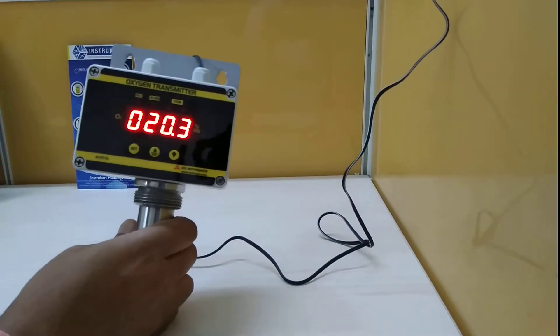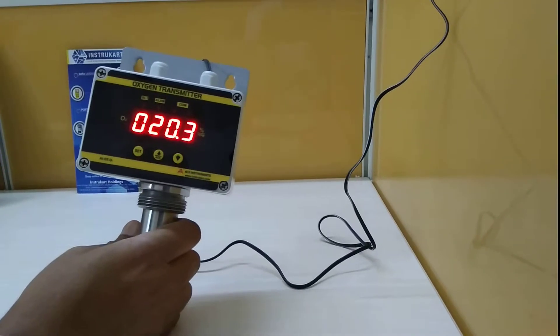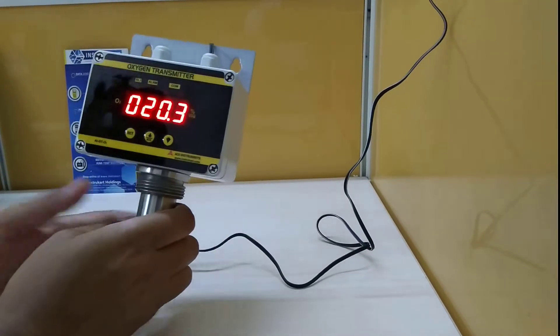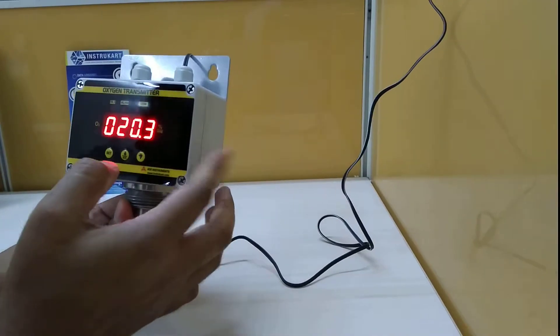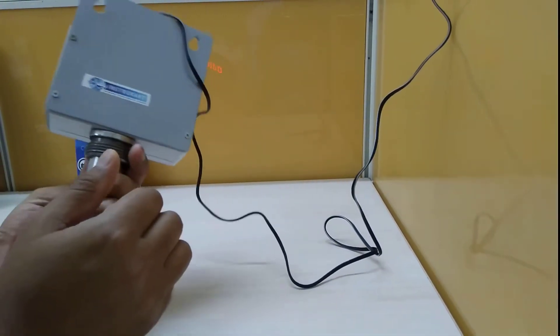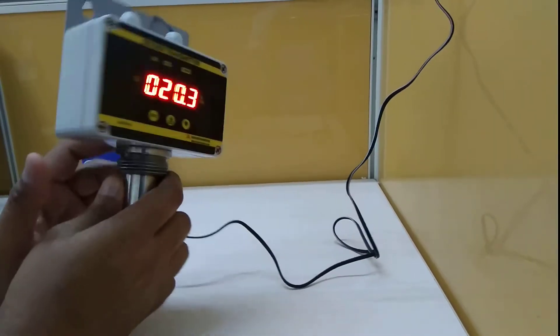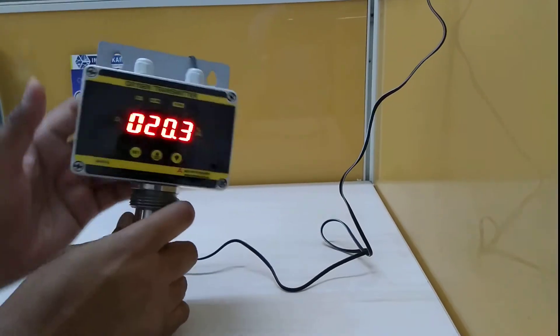You can replace the sensor in the field itself. It features an ABS plastic IP65-rated body with a 12-month warranty. It comes with a calibration certificate valid for one year and traceable to national standards.